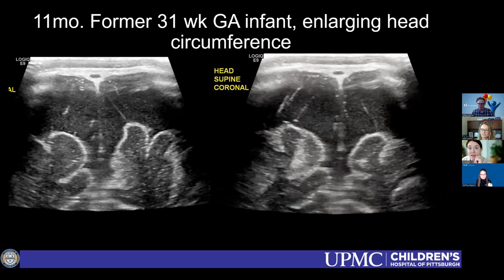Yeah, and I just have a quick little protocol tip. We have found that adding a cine clip, as I'm with Judy in the love of cines, adding a cine clip with very zoomed in images of the extraaxial spaces is also really helpful to make sure you're not missing a subdural in there. Yeah, agree.